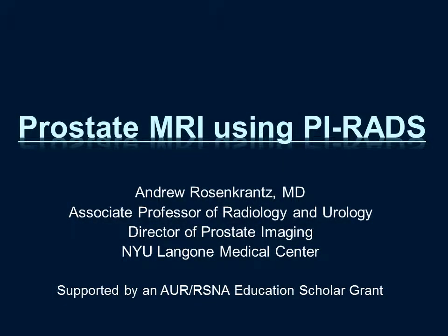This lecture is entitled Prostate MRI Using PI-RADS. I thank you for your interest. My name is Andrew Rosenkrantz. I'm an Associate Professor of Radiology and Urology, as well as Director of Prostate Imaging at NYU Langone Medical Center. And this talk is supported by an AUR RSNA Education Scholar Grant.